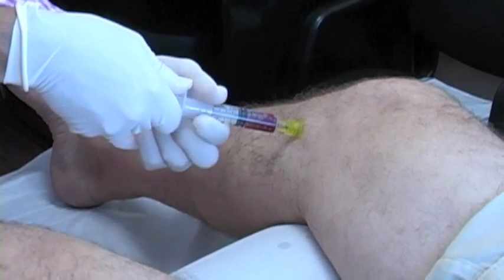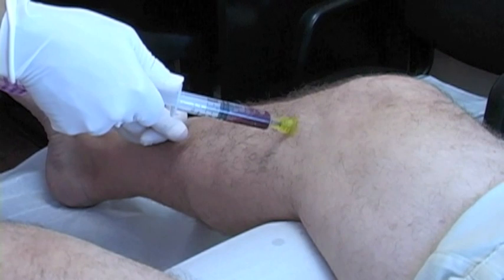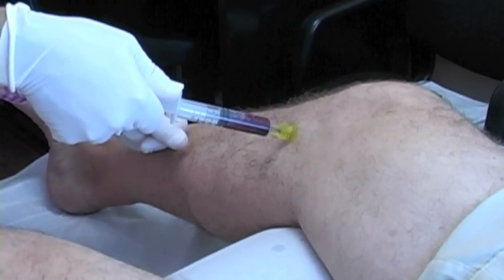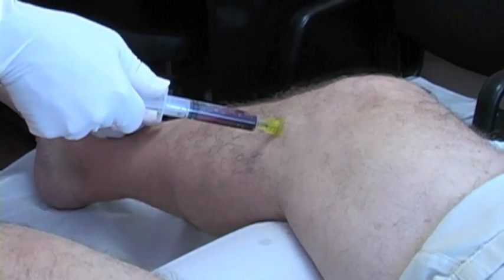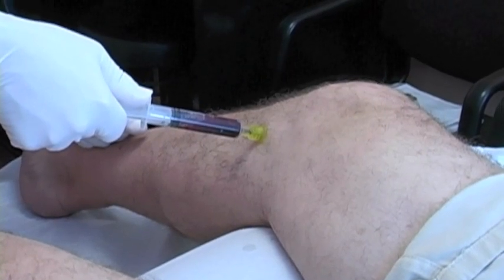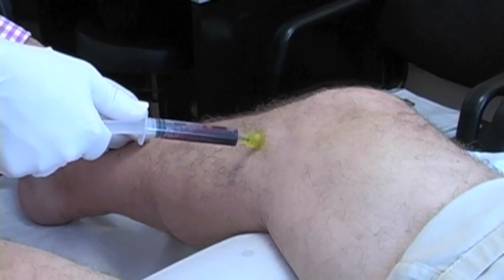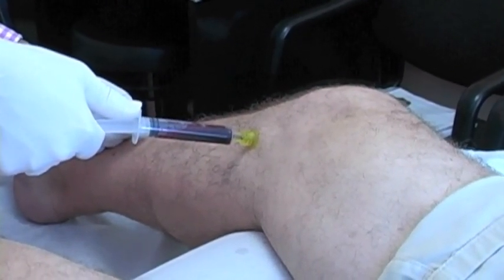Depending on how many joints will determine how much bone marrow aspirate you need for the prolotherapy solution. Because we're combining it with the lipoaspirate, we won't need as much bone marrow. A knee joint or a hip joint can only handle so much solution — most joints can't handle more than 10 cc's.